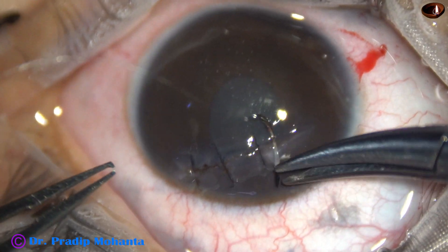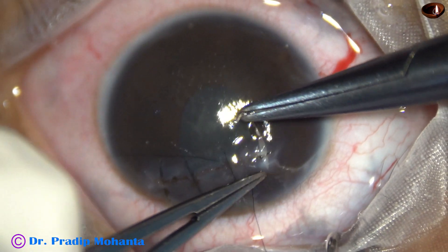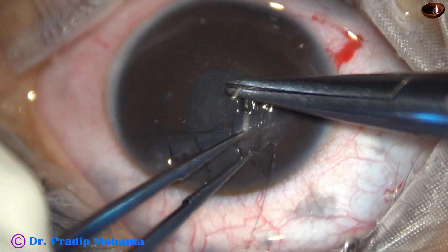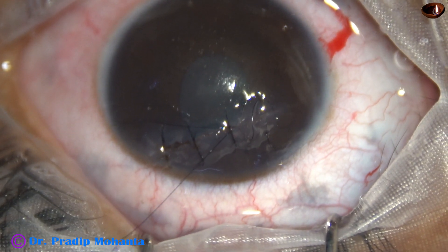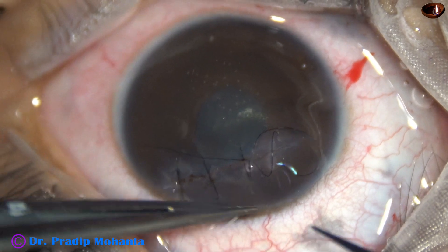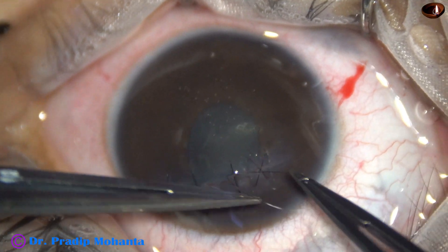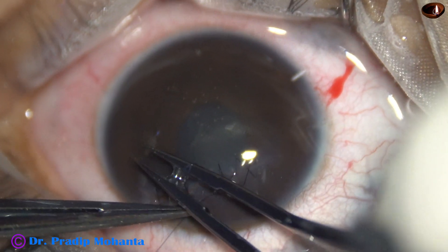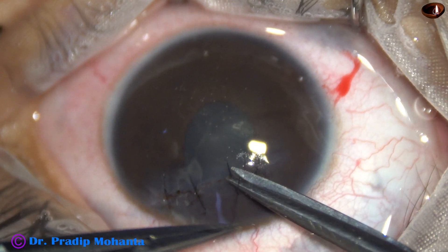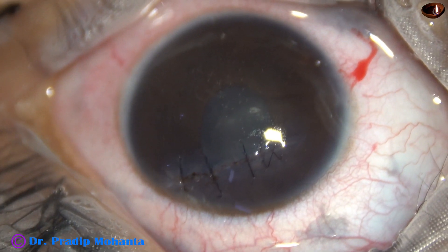Now this is going to be the X suture. The bite comes from the groove, then this bite is taken, and then another bite comes from the cornea in the groove and is taken out, so that the knot will automatically be in the groove. Again, visco to push the iris back, then optimum pull so that the cornea gets opposed. I pull the thread so that the knot goes into the corneal stroma and does not stay in the groove.